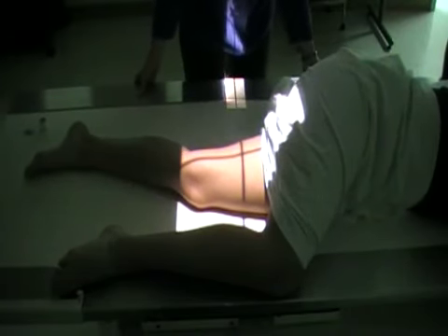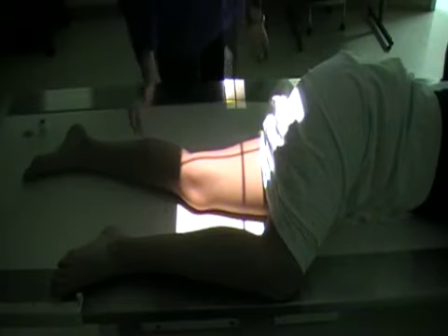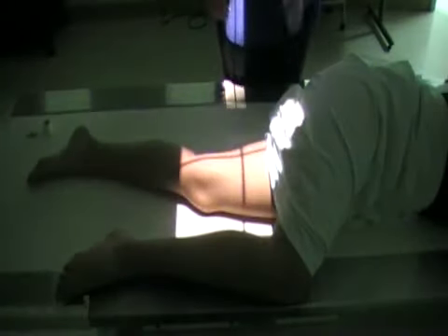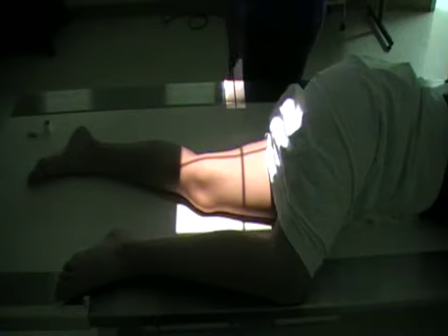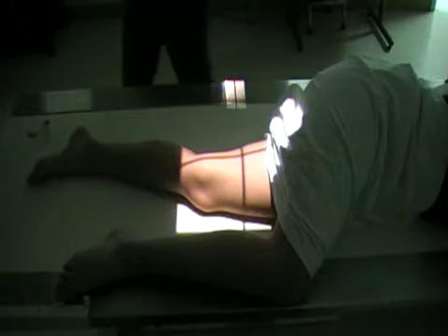beyond the knee. So the light field will look about 2 inches below the knee. Okay, the top of the light field will go all the way up till it hits this edge of the back of the thigh. Okay, so this will be our lateral knee, our lateral femur to include the knee. Okay, you can relax now.